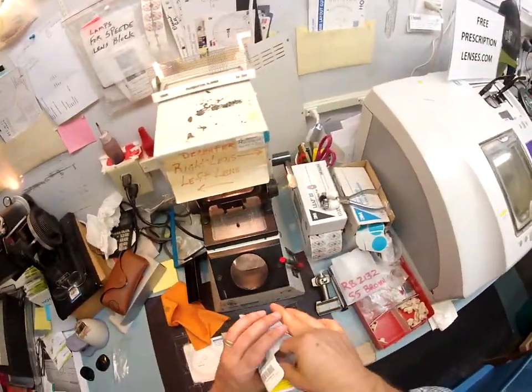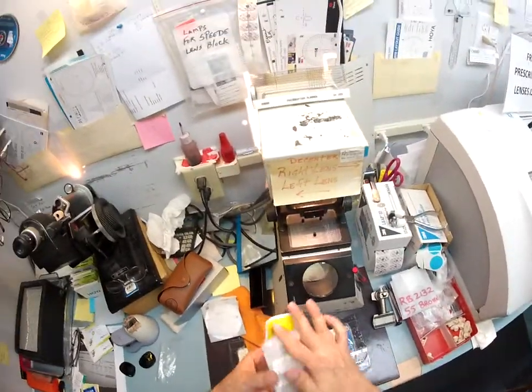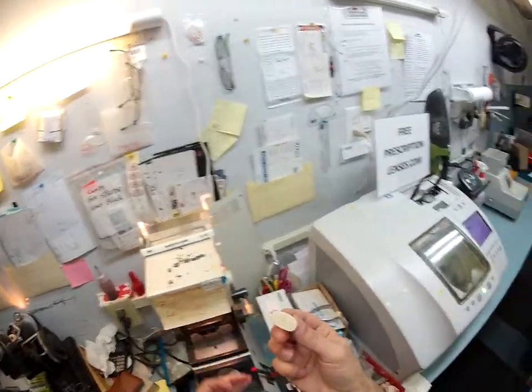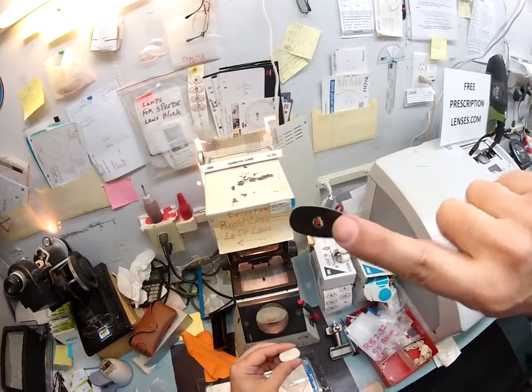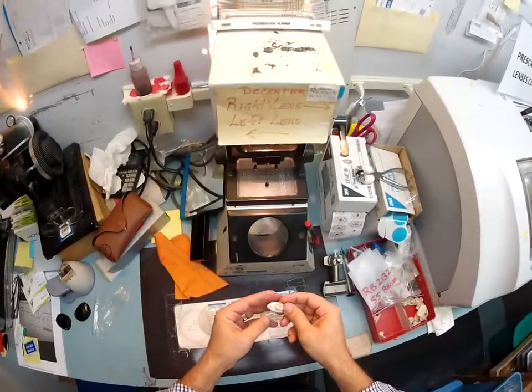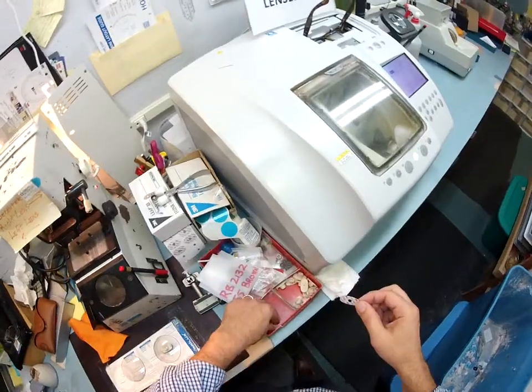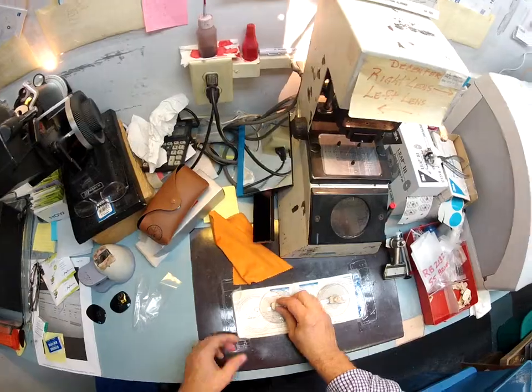So let me take your lenses out of the protective sleeves they come in, the little foam packet that's on top of that. Do the same thing for the left lens. Pull that out, let's trash that. I have to put a little block on there while it's cutting to go in the lathe. I've got a sticky pad from 3M. The black side is the sticky side. I'm going to put it on the block, pull the sticker off of this side and stick it right on the middle of your lens. Let's do the same thing for your other lens. Put that on that block, peel that side off, and let's make it sticky.